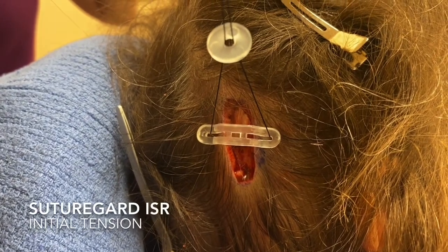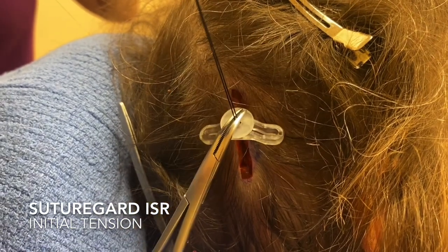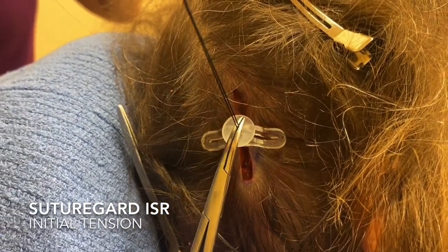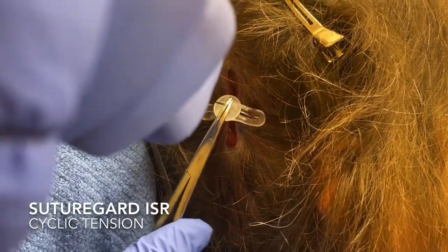Then I will pull up on the suture and push down on the guide and get the wound as close as I think I can initially. Coming back five minutes later, I'll pull up on the wound and push down on the guide again.